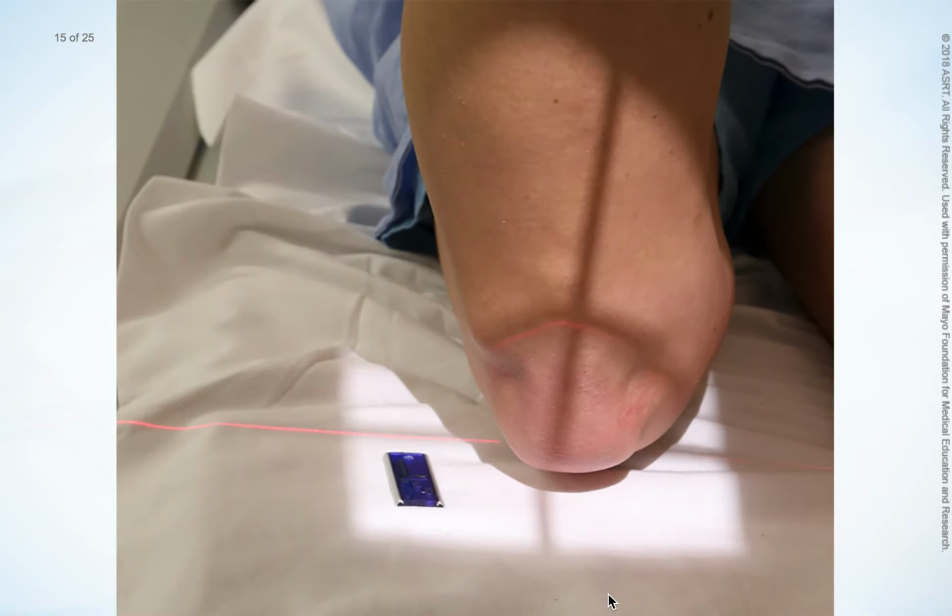Anatomical markers are placed on the image receptor to identify the anatomical side that is being examined. The patient's gonads are shielded, and the shield is placed between the X-ray source and the patient. The patient is instructed to hold very still, but no breathing instructions are necessary.